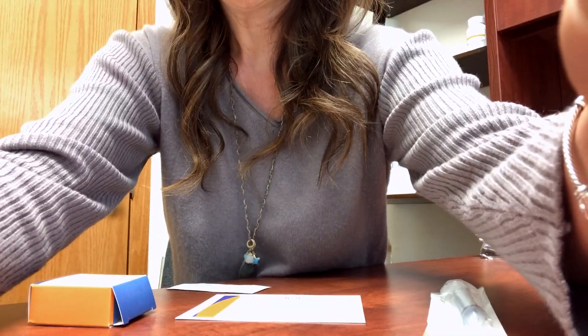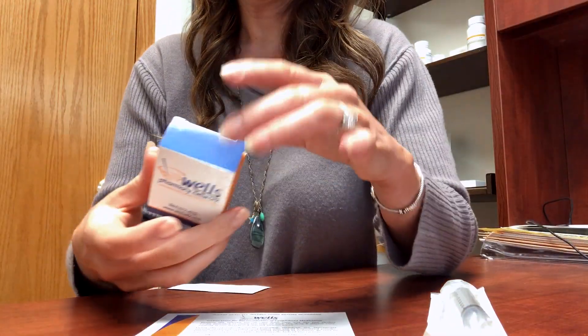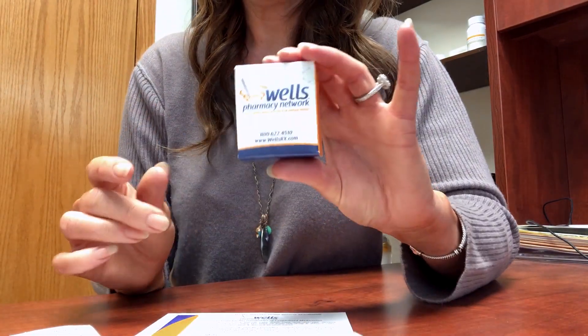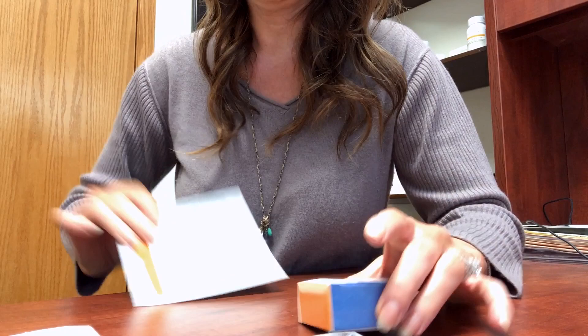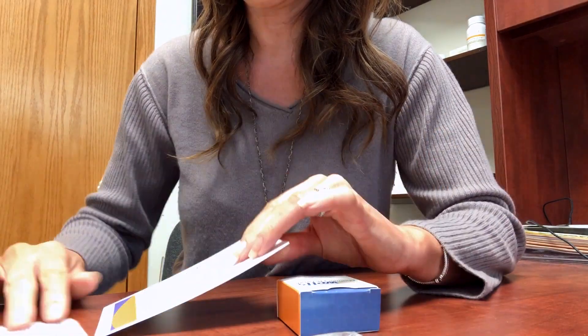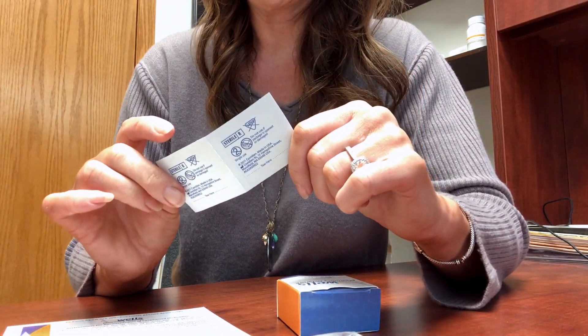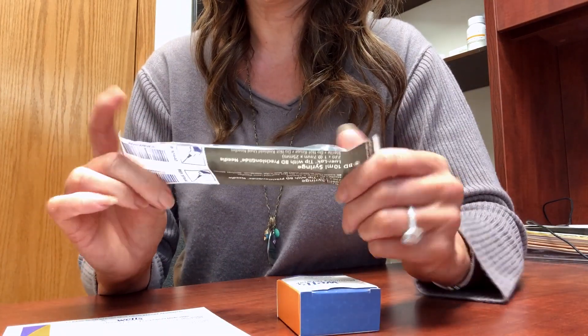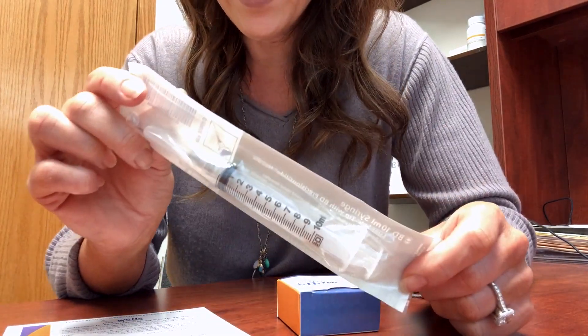Hi everyone. This is a video on how to reconstitute Sermorelin. When your kit arrives in the mail it should contain a handful of things: the medication, some instructions, two alcohol wipes, and a syringe that contains a needle.